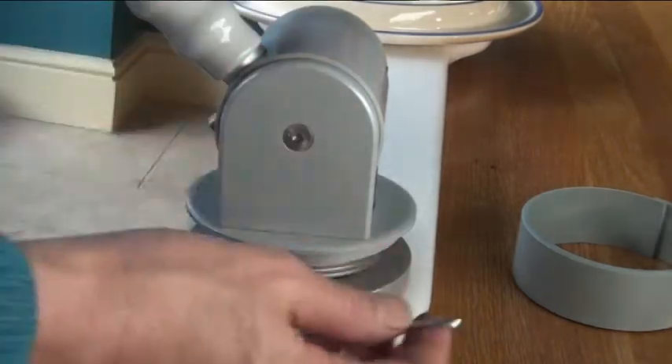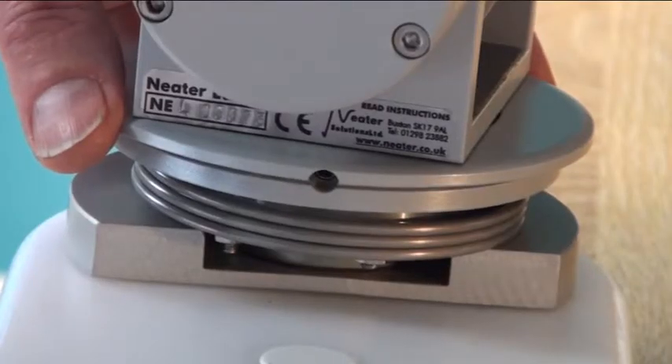Then you'll need to find the hole. Release the screw in the top ring.